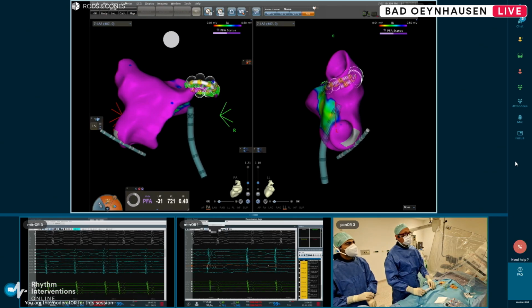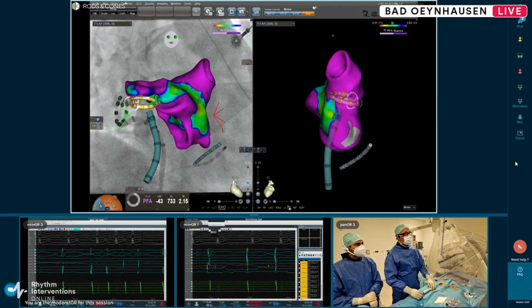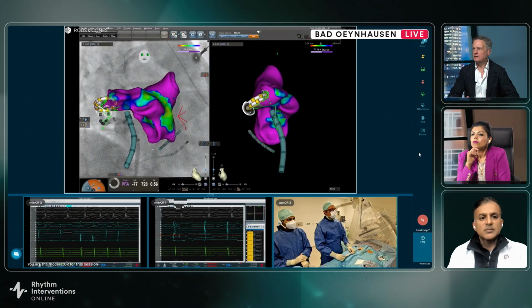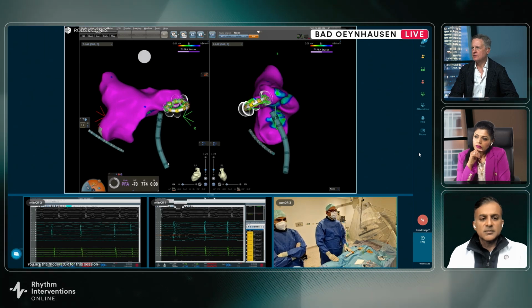Please go to RIO, Dr. Kalaf. Oops, we dropped the catheter. Christian, can you just quickly explain the contact and the calibration again to us, please?